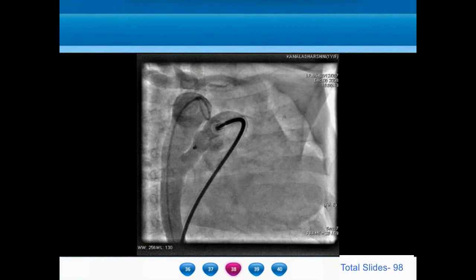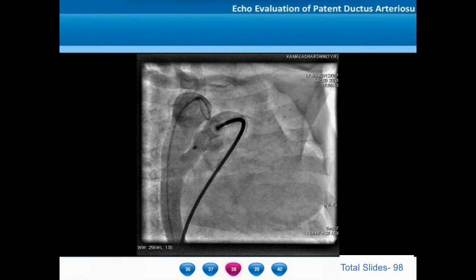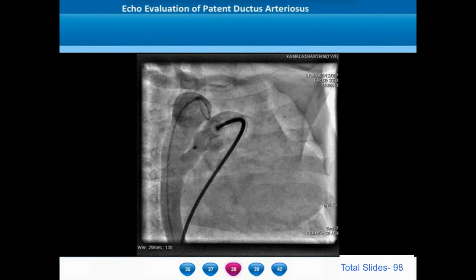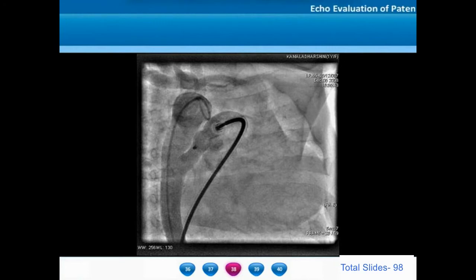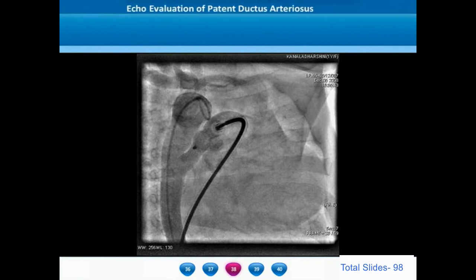Yet another cause of an abnormal PDA course is a patient with a right descending thoracic aorta and a long tubular ductus arising from the mid thoracic aorta, ascending up in the mediastinum and getting inserted in the pulmonary artery bifurcation. These ductus will not be visualized along their entire length and width in the standard ductal views and suprasternal views.